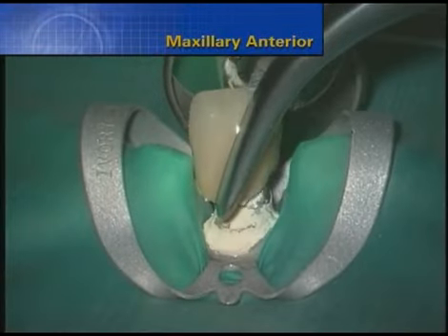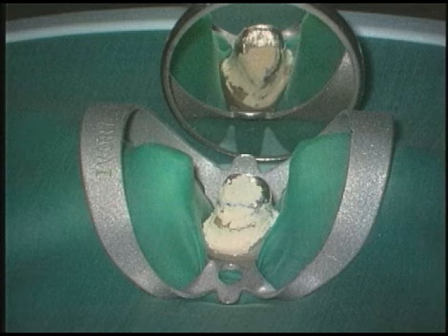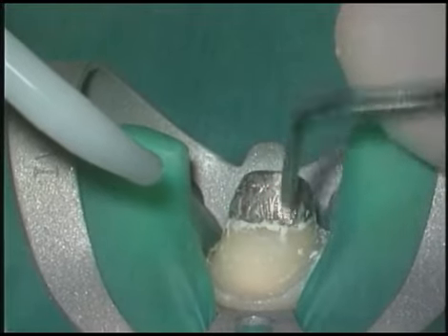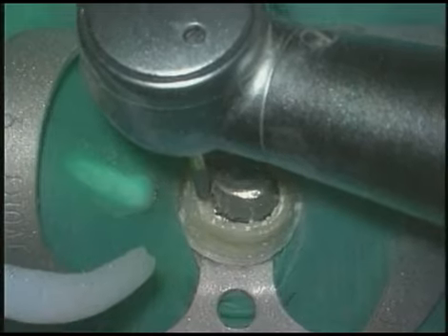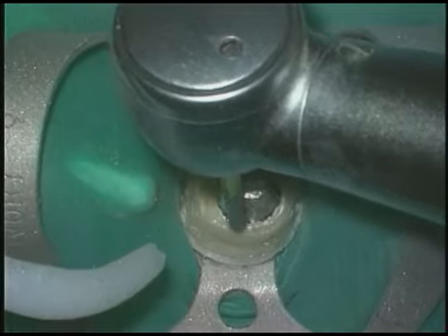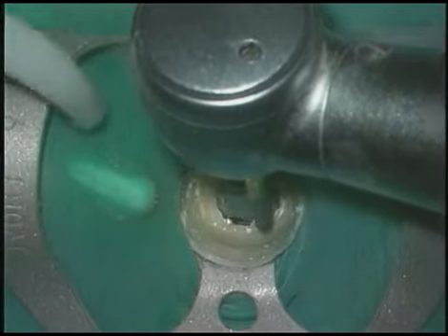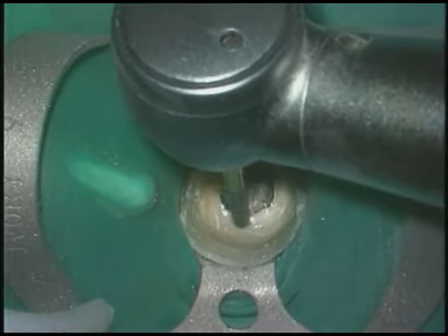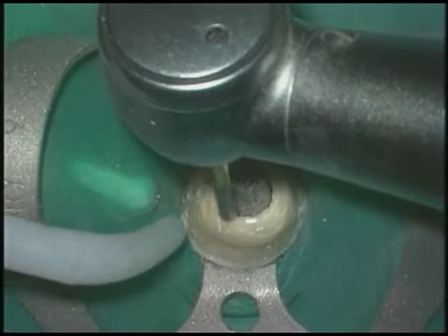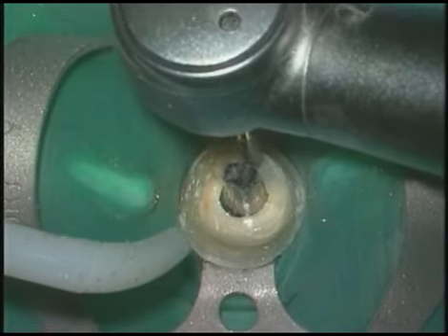Here is a mirrored image of a maxillary central incisor with a porcelain fused to metal crown. The PFM crown is removed, exposing a cast core and post. A curette eliminates residual cement. Gold is fairly soft, so it's not too difficult to begin to machine this core down. And we're going to machine down the core so that its cross-sectional diameter will approximate roughly the size of the number 5 trephine. Be careful not to needlessly over-reduce the core, because then it could render the post-removal system useless.